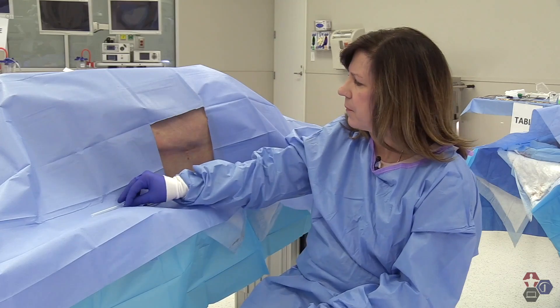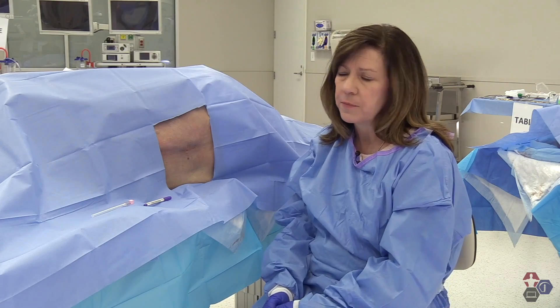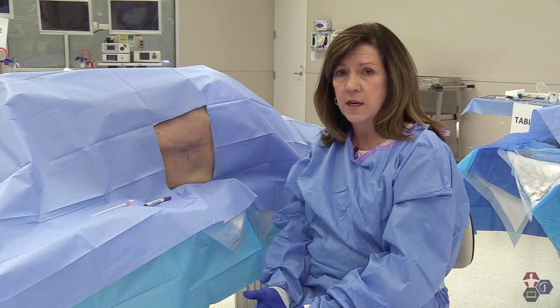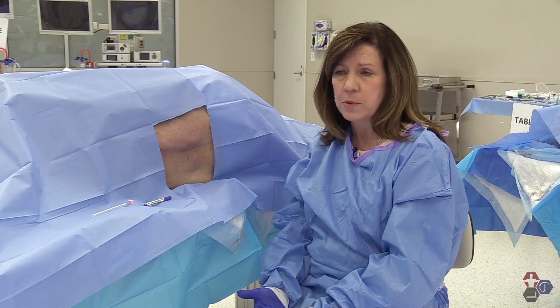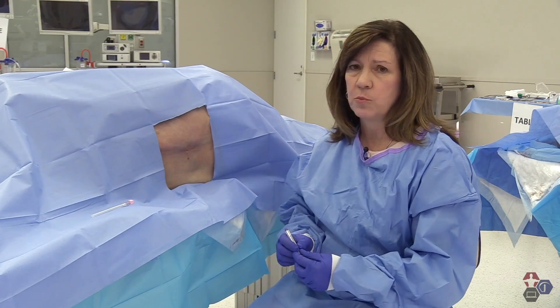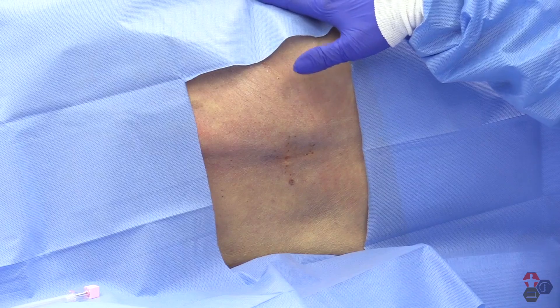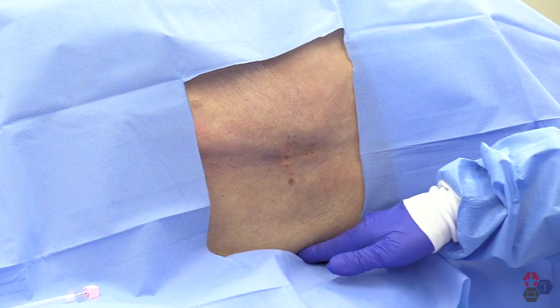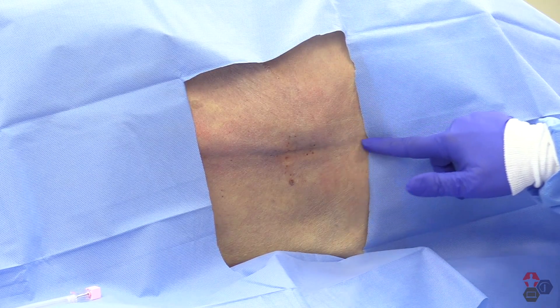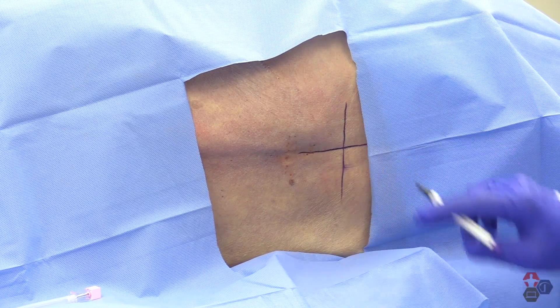This is a cadaver specimen already positioned and draped in sterile fashion in a left lateral decubitus position. Some providers choose to use a sitting upright position to do this procedure, but for the purposes of demonstration we're going to use the left lateral decubitus position. I'm going to use a tissue marker to highlight the anatomical landmarks that are important. The iliac crest on the right and on the left are identified by palpating manually, and where it intersects with the spinal column is approximately at about the L3-4 junction.